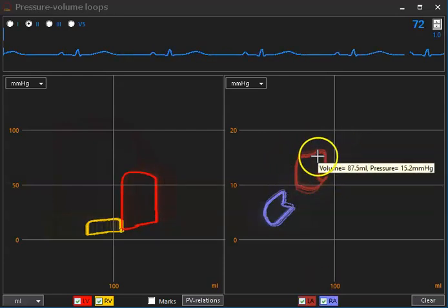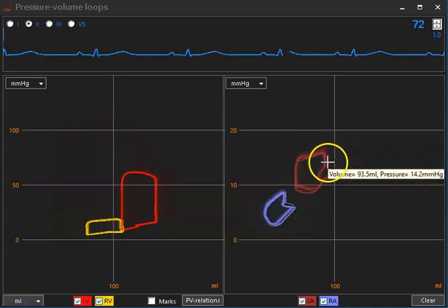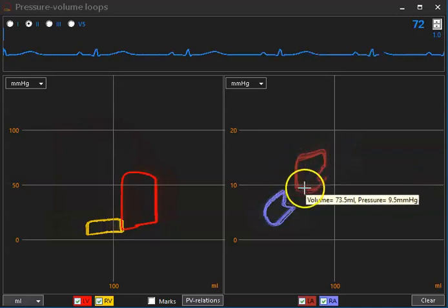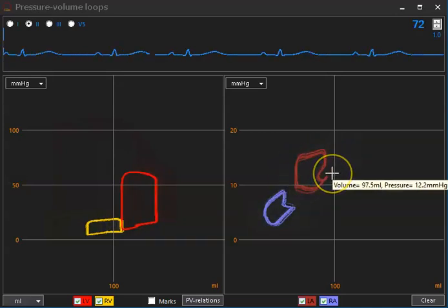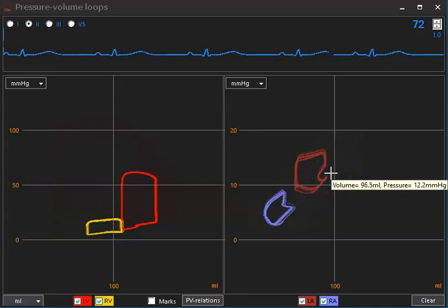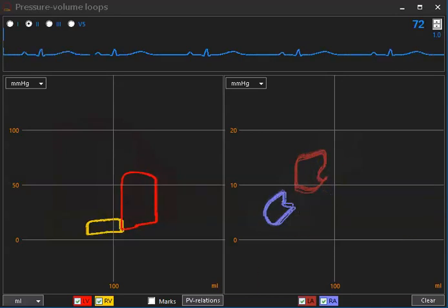I will now increase right heart function, and please notice what happens with left ventricular loading and left atrial pressures.